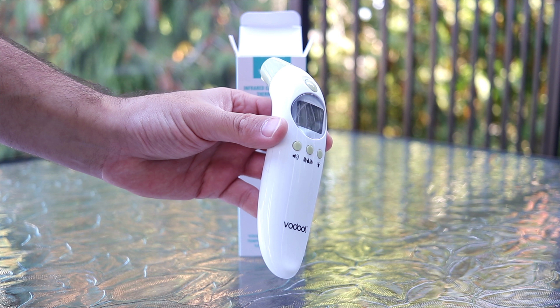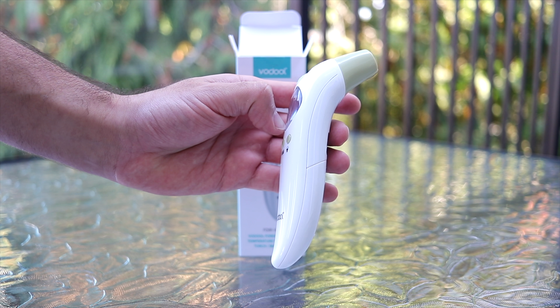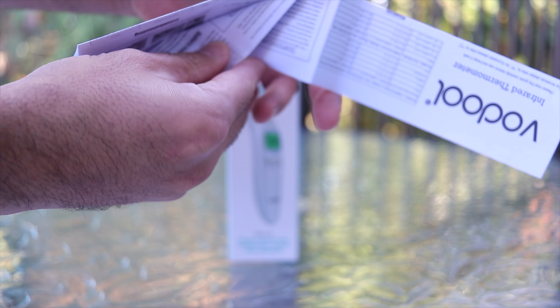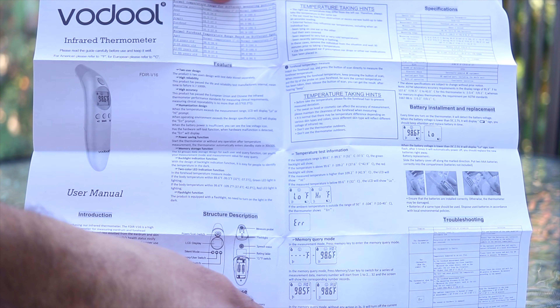The thermometer is made out of high quality plastic materials. The buttons on it are all very easy to press and feel really good quality. Next inside the box we have the instruction manual, which goes over all the different functionalities and settings for the thermometer.